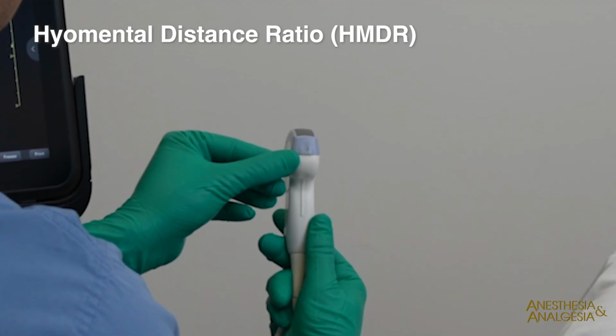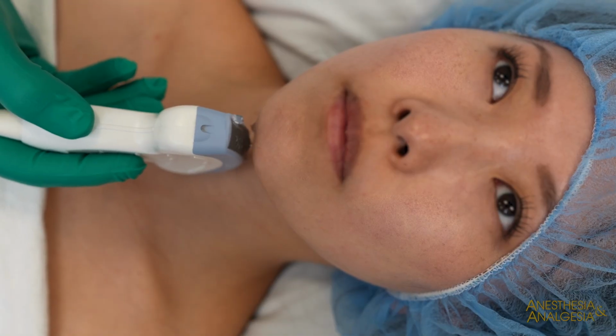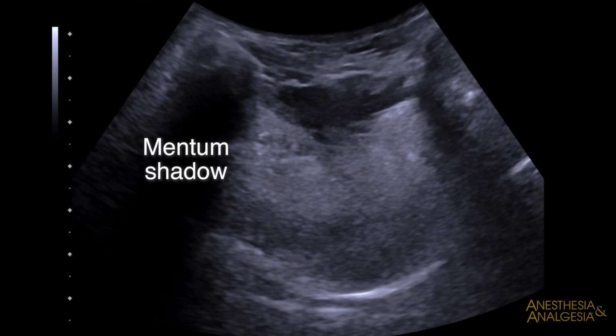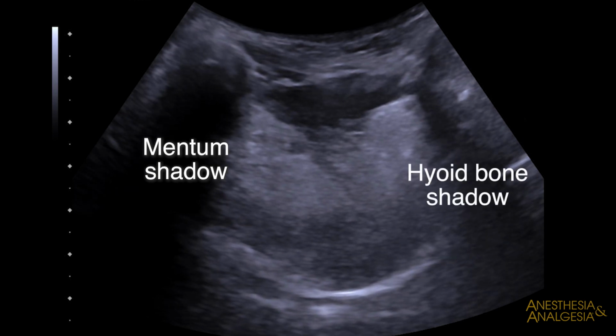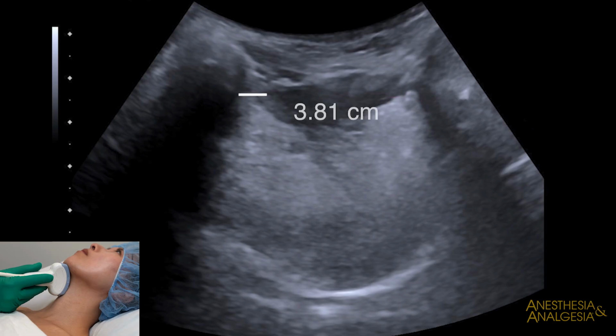To evaluate the hyomental distance ratio, a curvilinear probe is required. Place the probe in the sagittal plane beginning at the mentum with the indicator pointing cephalad. The mentum shadow appears on the left side of the ultrasound screen, and the hyoid bone shadow appears on the right side of the screen. First, measure the hyomental distance with the head and neck in neutral position. The measurement should be taken as a horizontal line from the mentum shadow to the hyoid shadow.